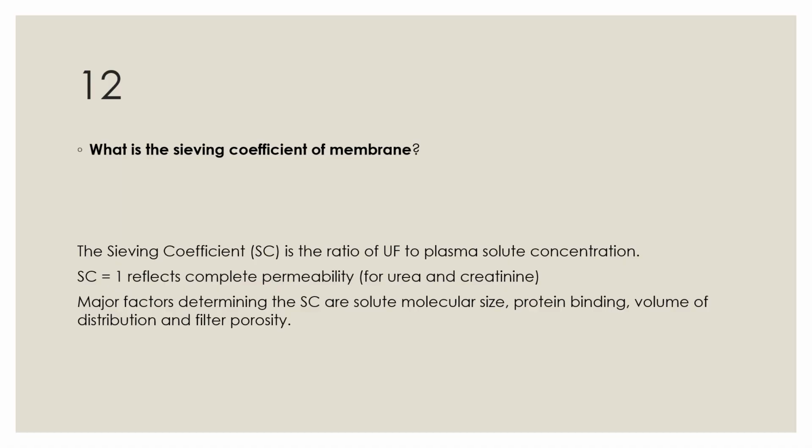What is sieving coefficient? The sieving coefficient is the ratio of ultrafiltrate to plasma solute concentration. Sieving coefficient 1 reflects complete permeability for that solute, meaning whatever concentration of solute is present in plasma is the same in ultrafiltrate. Sieving coefficient 0 reflects complete impermeability. The major factors determining the sieving coefficient are solute molecular size, protein binding, volume of distribution, and filter porosity.